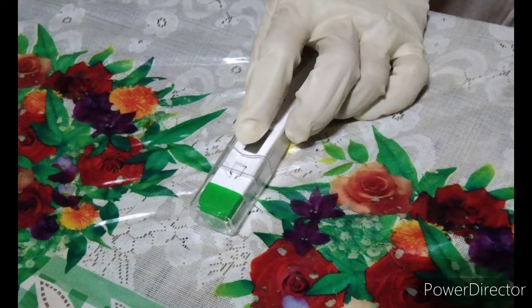Observe the aspirate's appearance. Gastric fluid is usually cloudy and grassy green, tan, off-white, or brown in color. In contrast, intestinal fluid is usually deep golden yellow and is clearer than gastric contents. Consider the results of pH testing and aspirate's appearance together. An aspirate with a low pH and typical gastric fluid color indicates a high probability of gastric placement. In contrast, a golden colored aspirate with a high pH indicates a high probability of intestinal placement.